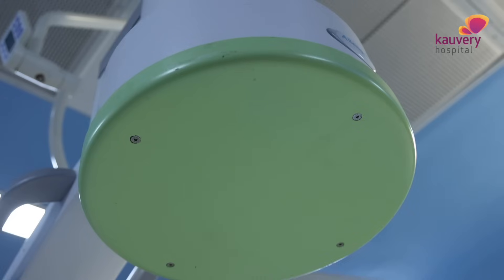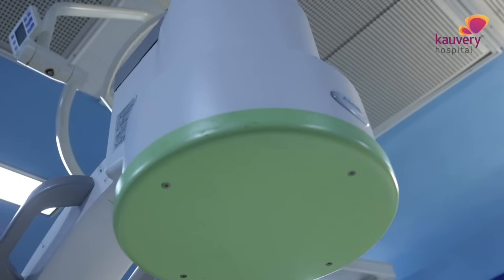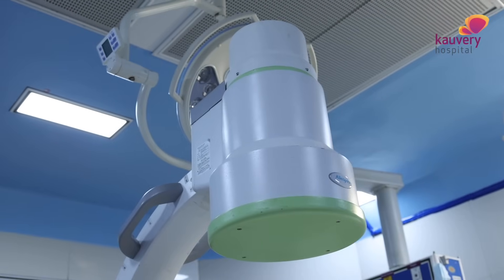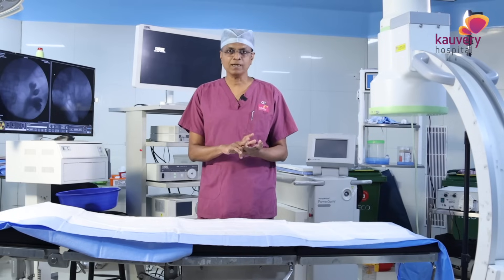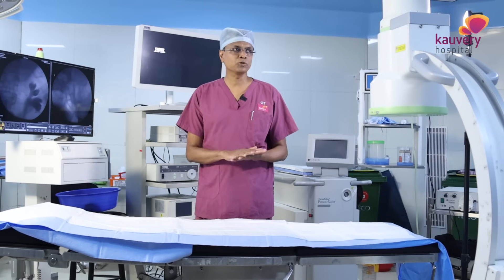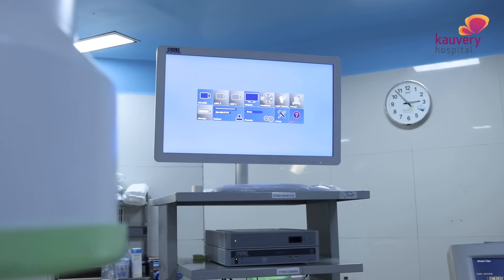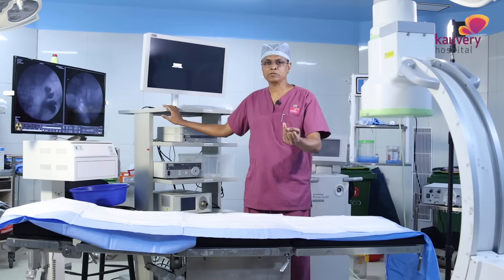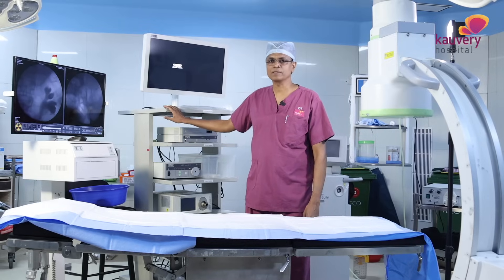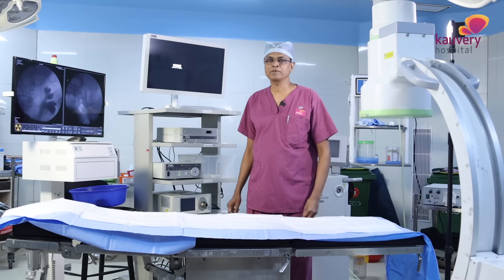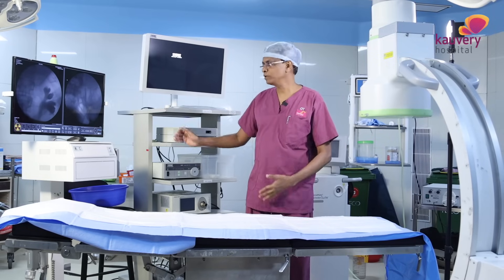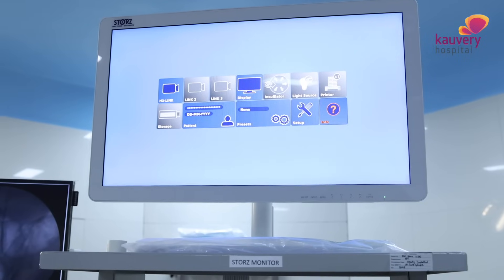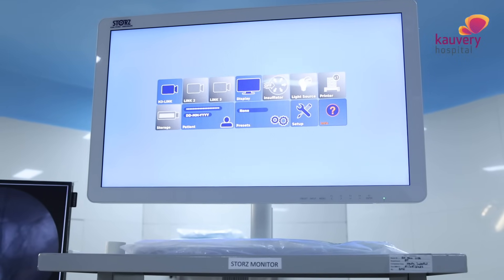We can also see via X-ray guidance where the stone is located and where the instrument is being passed, ensuring correct instrument placement. This camera system is the baseline for endoscope, laparoscope, and other procedures. Whatever we do is magnified at least 10 times, making us more accurate during the procedure.